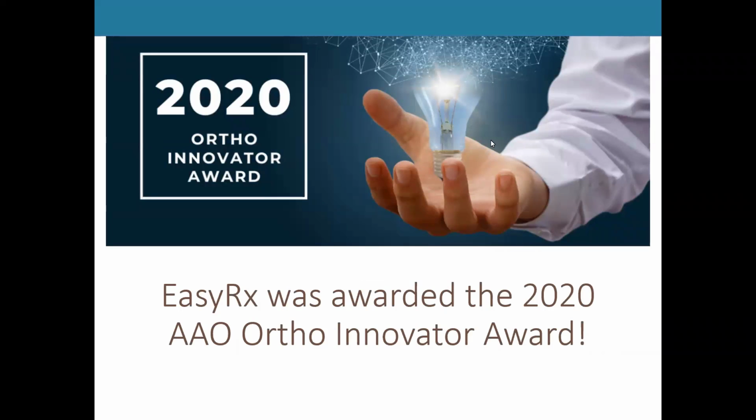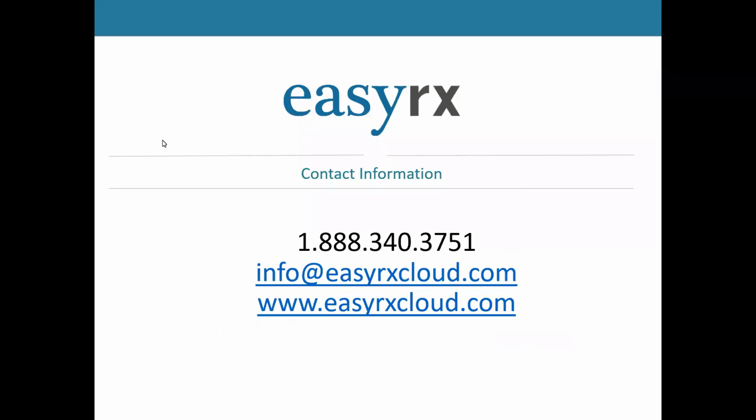And then, just touching on this, we were really excited. Last year we were awarded the Ortho Innovator Award from the AAO. With EasyRx, we want to become the standard of care for orthodontic practices. So we felt like this was a great honor and an achievement. So just touching on that. And now let's get into the software.